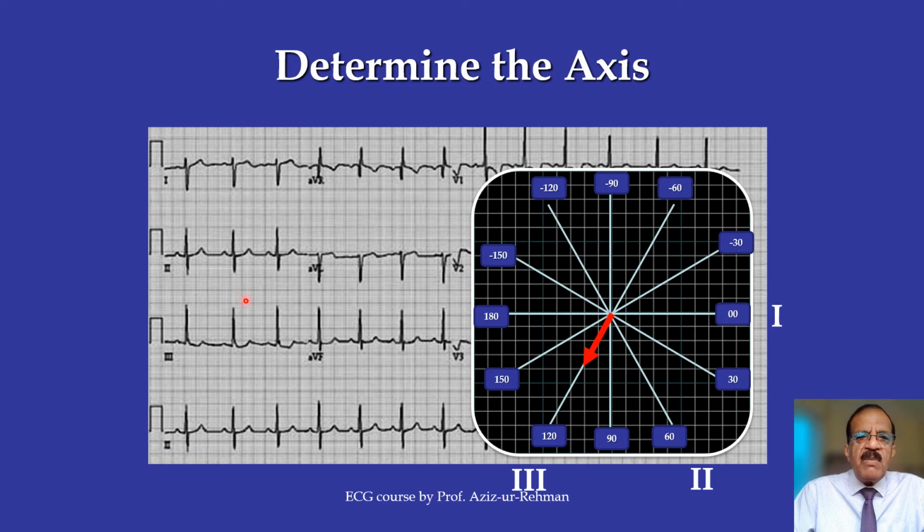And when we determine height, we actually subtract the negative part also. I'll just demonstrate it shortly. So this is the first step. The second step is you choose any ECG lead which has a predominant QRS, theoretically somewhere at a distance, not this one, like we can take this lead 1.